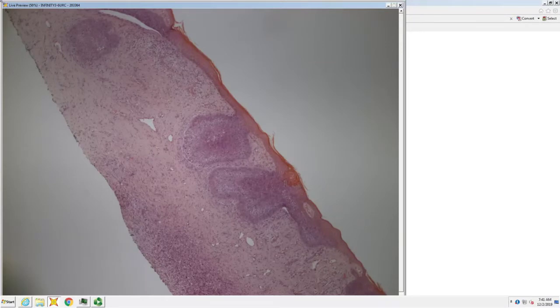You have what looks like superficial BCC and a little bit of DF underneath it. It's a sucker slide trying to sucker you into basal cell when it's just induction over a dermatofibroma. So that's an important pitfall, an important thing to know.